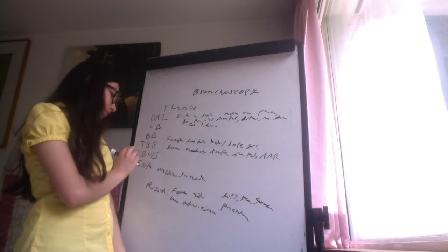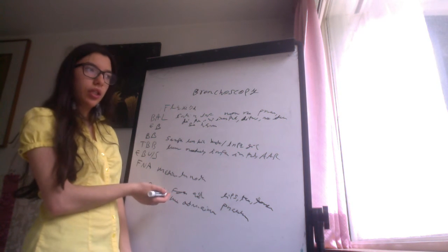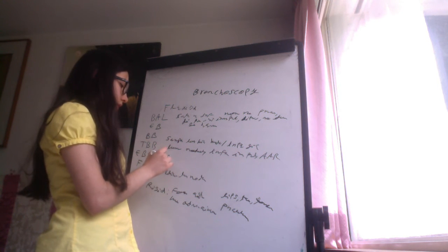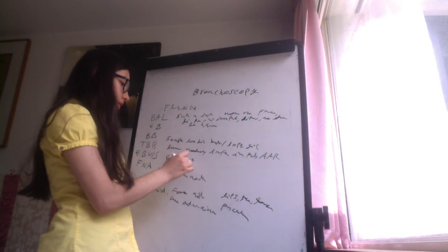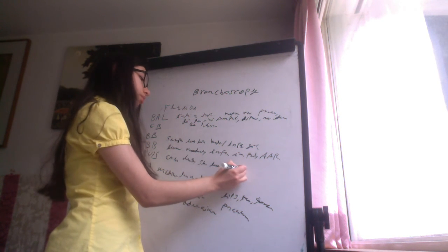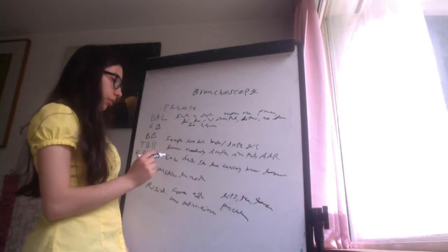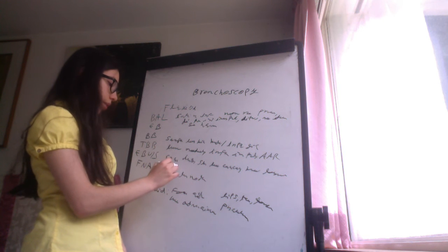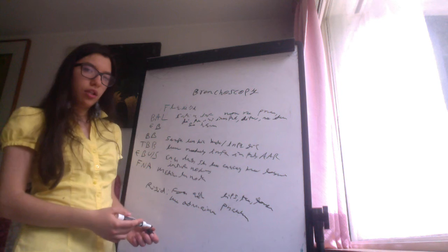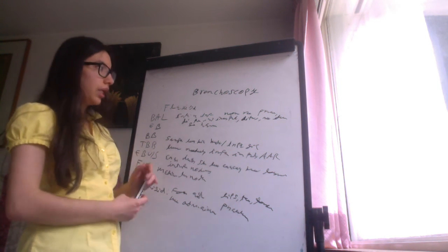And the endobronchial ultrasound is an ultrasound in conjunction with a bronchoscope, and the indications are endobronchial lesions, staging of lung cancer, mediastinal lymphadenopathy, or intrapulmonary nodules. This is done to visualize the airway walls and surrounding structures.